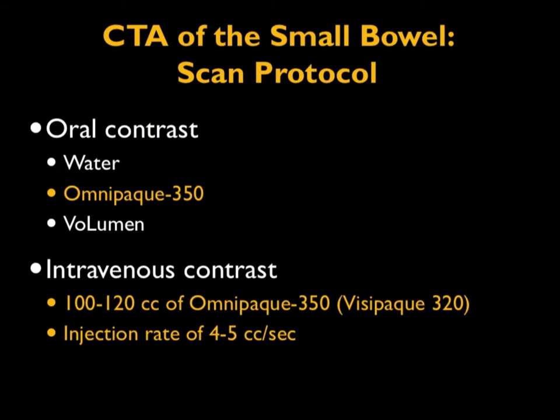Okay, so this will be on small bowel tumors. And of course, we always talk about protocols. There are many different ways to look at the small bowel, and we've discussed this in the past, be it neoplastic or inflammatory disease. Water is a great contrast agent as long as you're giving IV. Some people like positive contrast, and if you're looking for fistulous tracts or communications, oral Omnipaque works well. And remember, now there's a new product, oral Omnipaque, preset 500 ml containers, which works very nicely.